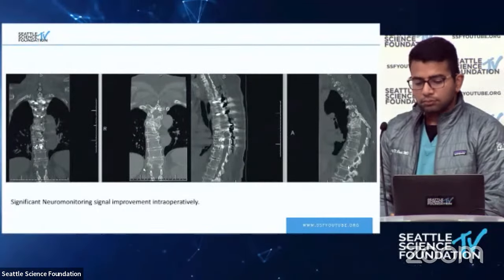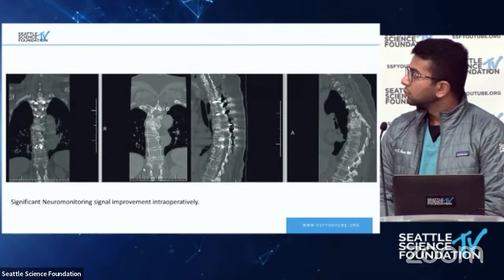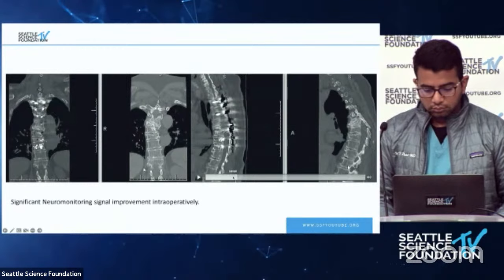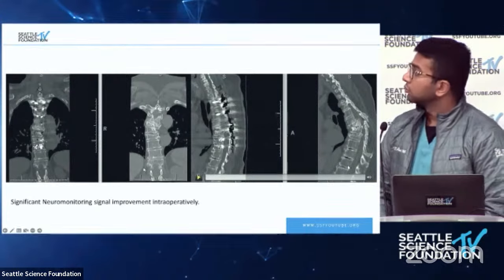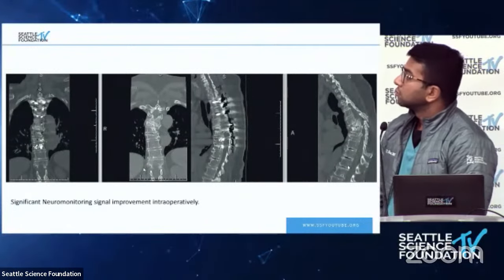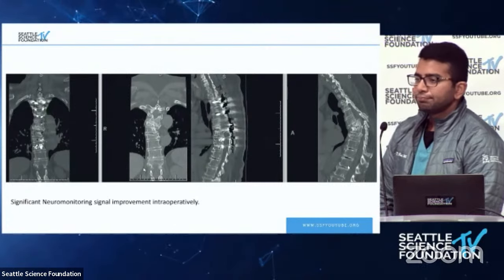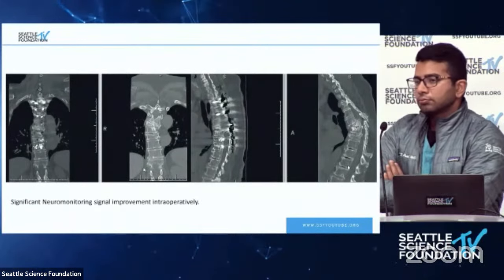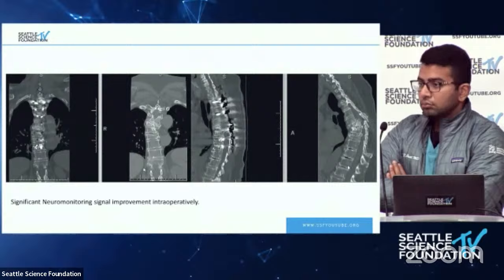Rod, any plans to put a cage in, and where are you? You've done a lot of far lateral surgeries. Is the thoracic spine something that you can access through the ribs or something like that? I mean, I think for me, I don't really need a cage in this situation. I think if you're going to do vertebrectomy, you can probably do that as well. But this was a very compromised patient. She was really sick, and she just needed that focal correction. Actually, it was very difficult to get that osteophyte. It was pretty stuck to the cord and the dura. So, what do you think, Jens?